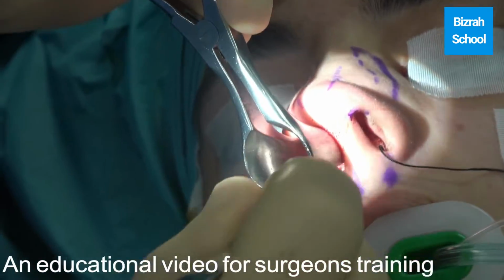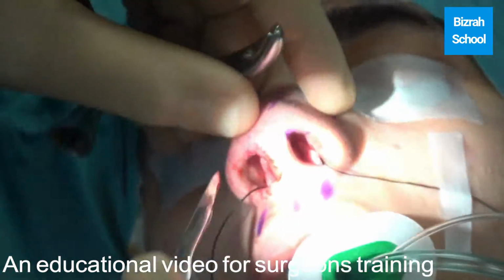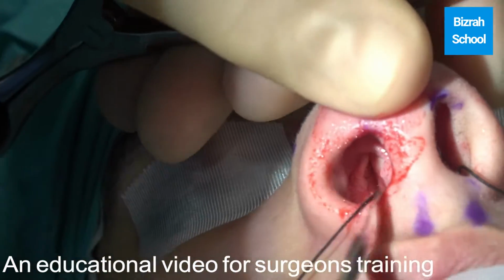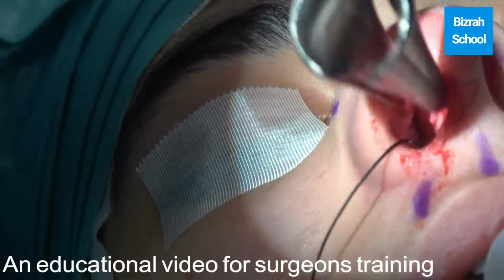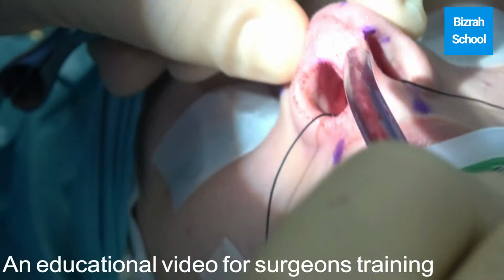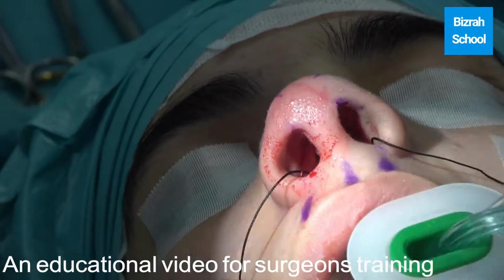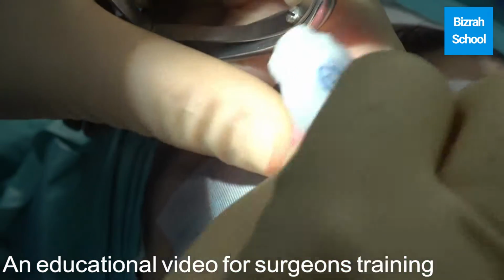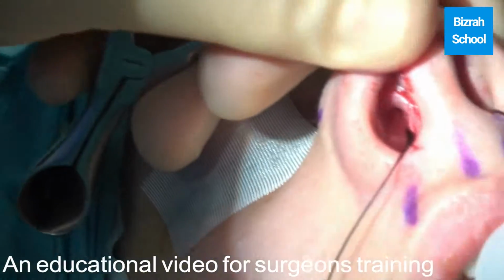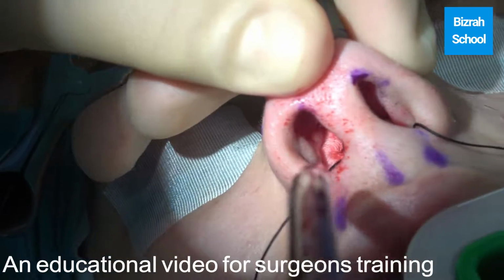To correct now the caudal dislocation, just underneath the foot, see, it's being corrected now. You see the flap is returned back to its normal position very nicely, and the caudal dislocation is corrected straight away, as you see now. So we finish the septoplasty with the correction of the right caudal dislocation. You see the flap now very nicely returned back inside the midline to a normal position without caudal dislocation.